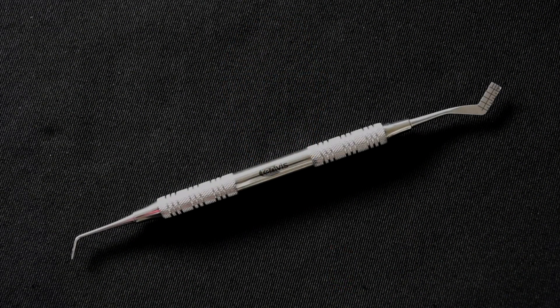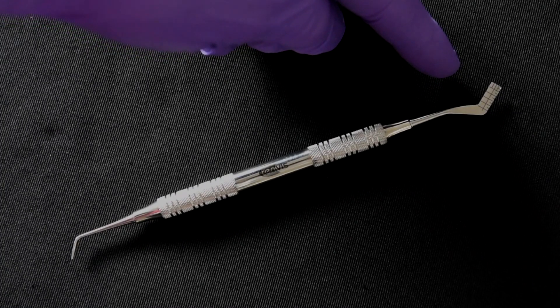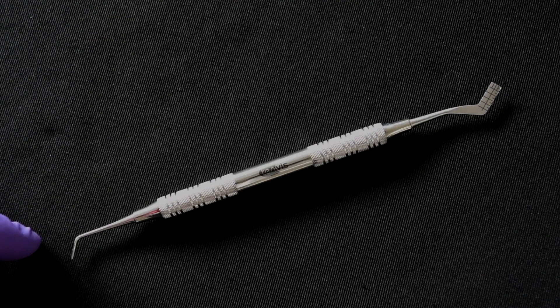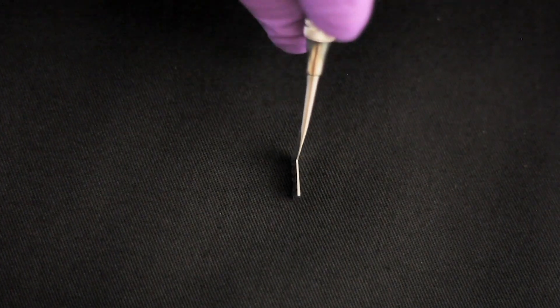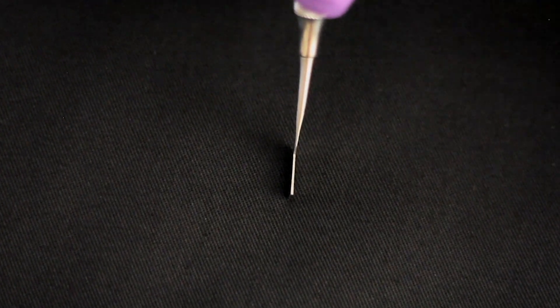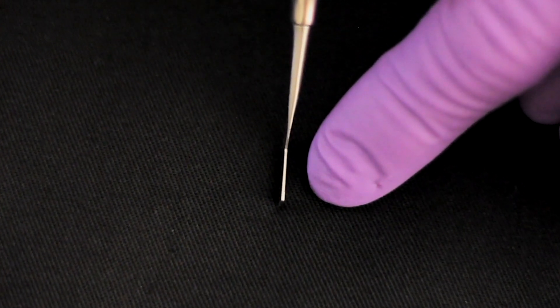Now if we have a closer look at the instrument we can see that at one end is shaped like a hockey stick and has millimeter markings on it, and at the other end is a stiff probe, angulated at 45 degrees to the long axis of the instrument. Now if I turn the hockey end on its edge you can see that the end is flat and parallel sided the whole length of the blade.